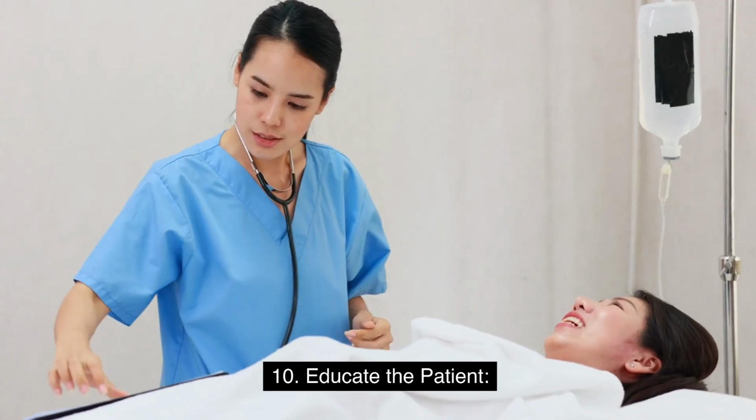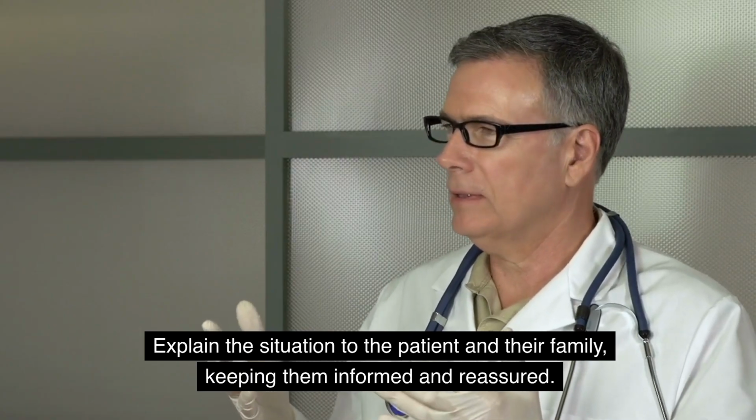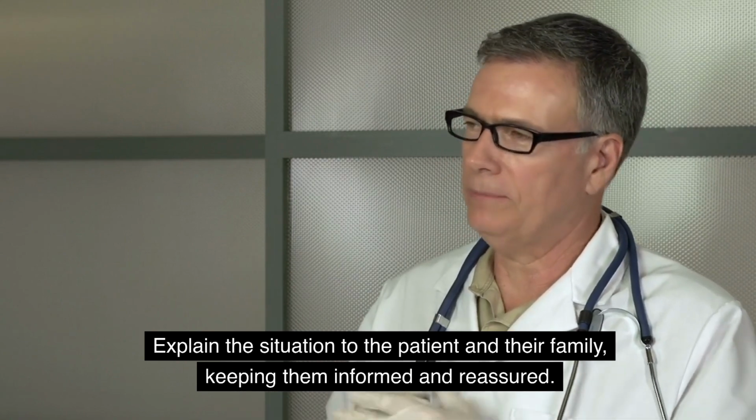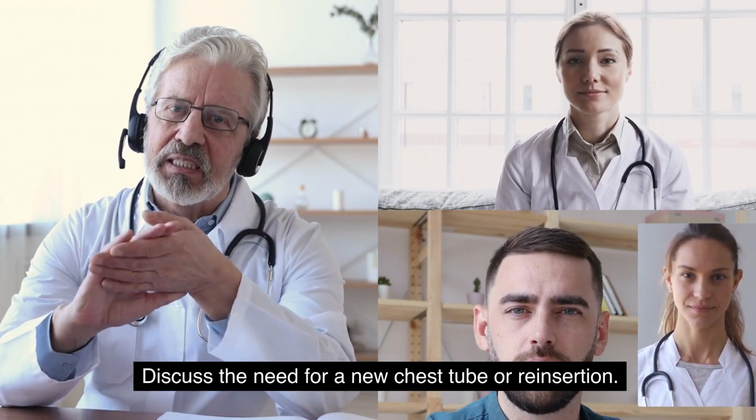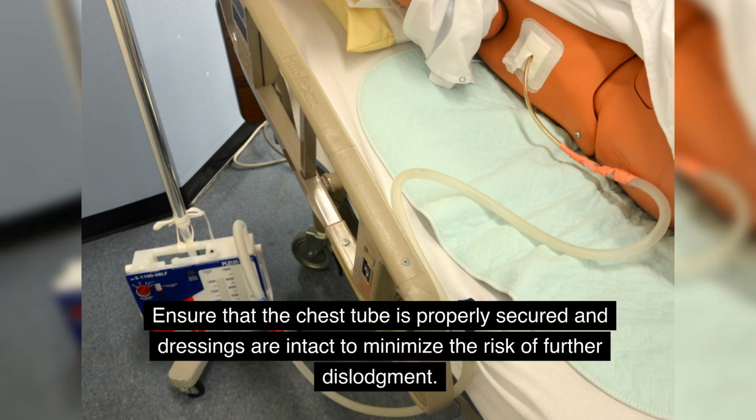10. Educate the patient. Explain the situation to the patient and their family, keeping them informed and reassured. Discuss the need for a new chest tube or reinsertion. 11. Prevent future dislodgement. Address the cause of the dislodgement. Ensure that the chest tube is properly secured and dressings are intact to minimize the risk of further dislodgement.